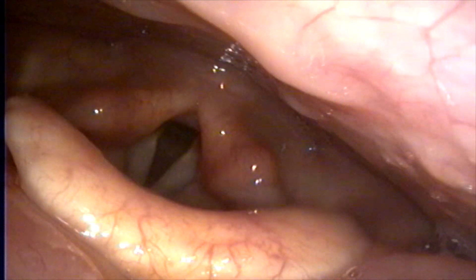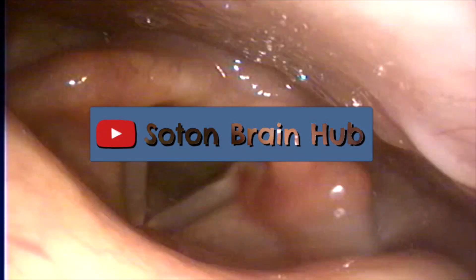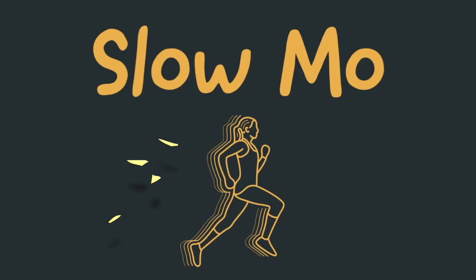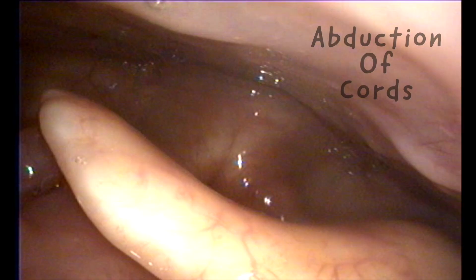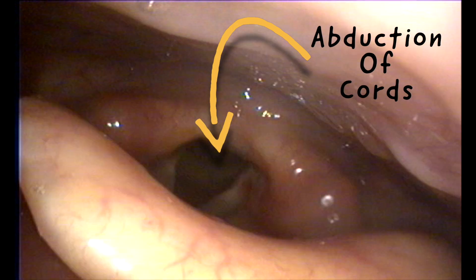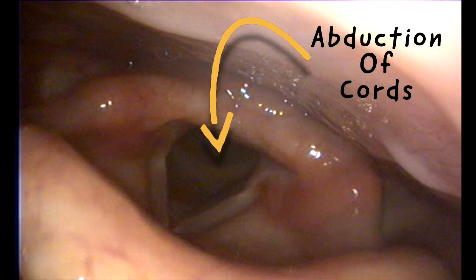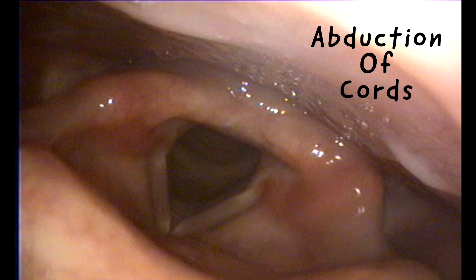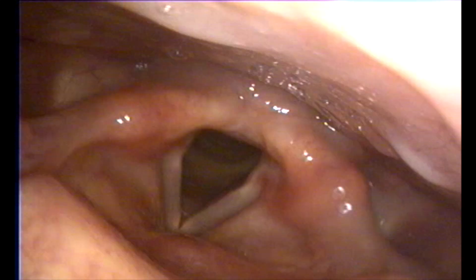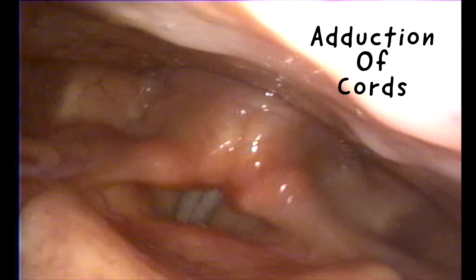Before we end this video let's take a quick look at the movement of the vocal cords in slow motion. Firstly we will be able to see the cords moving apart — this is called abduction. We will now be able to see the cords moving together — this is called adduction. Remember that adduction adds the two sides together.